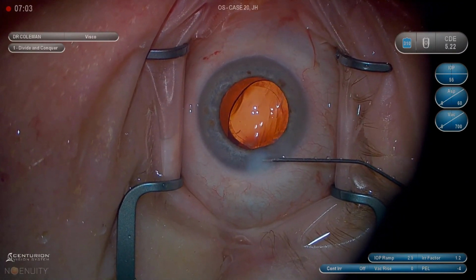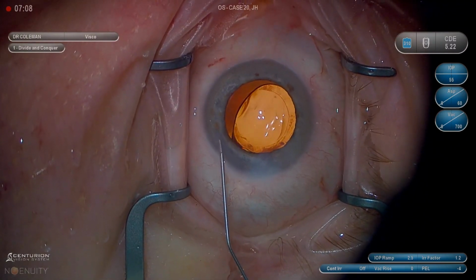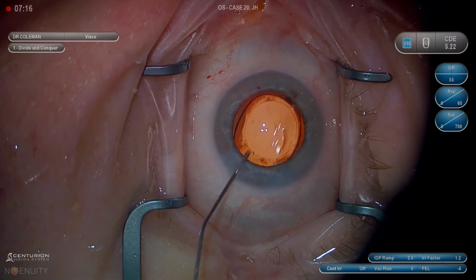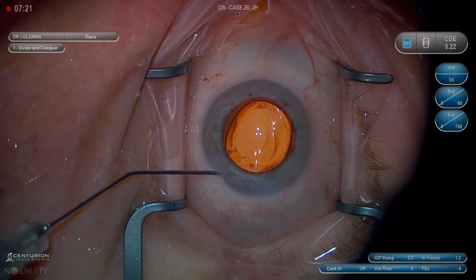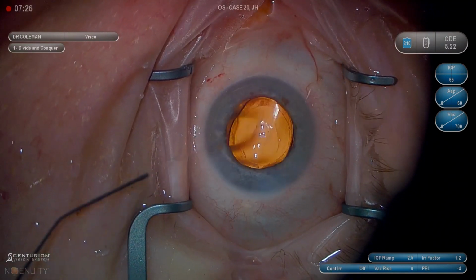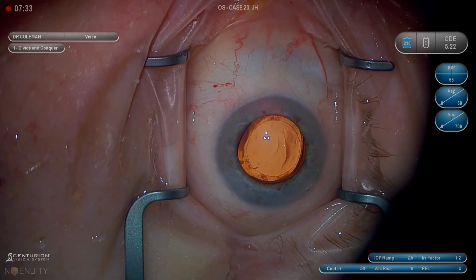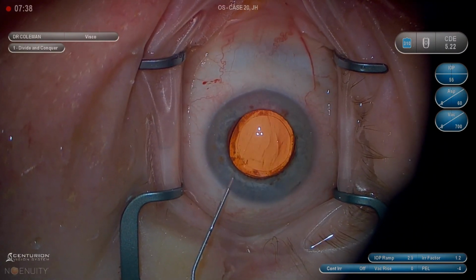If it's still leaking, don't put a stitch yet. Take a Weck-Cel, soak the Weck-Cel completely in tetracaine if you have access to it, where it's dripping off the end of the Weck-Cel. Hold it on the wound for 1 minute. The theory behind this is that compared to corneal stroma, tetracaine is hypotonic. Water flows to the relatively hypertonic stroma, and it will diffusely hydrate around the wound in places that you can't just directly hydrate with the BSS cannula. That will save you a lot of stitches.